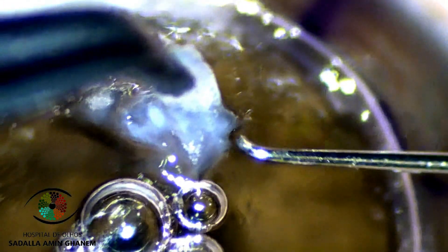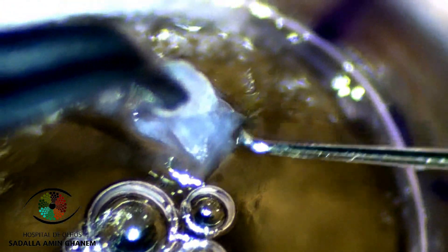The final step is trying to remove as much as possible from this previous hydrops scar. As you can see, this is not a central scar, so I decided to debulk this stroma to remove as much as possible but to leave this small scar, which will not compromise visual acuity significantly.